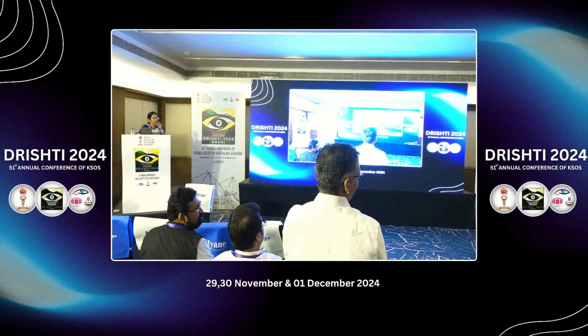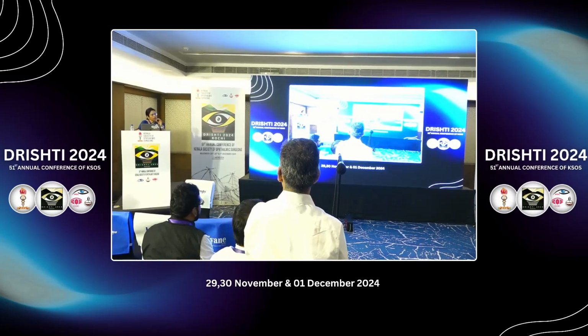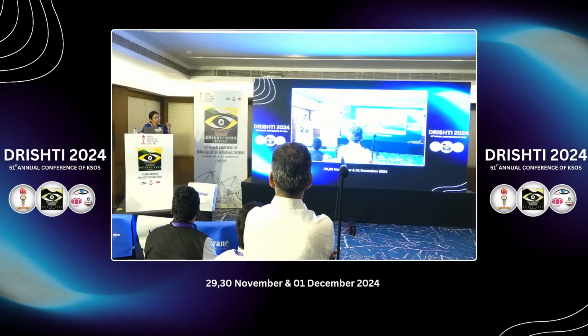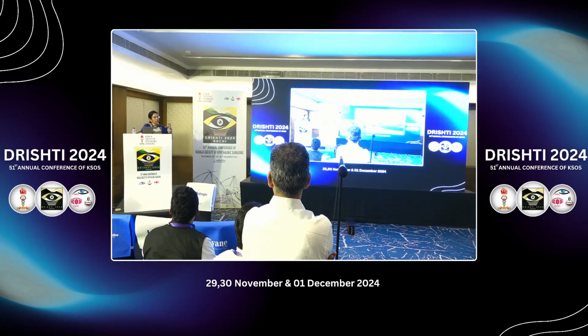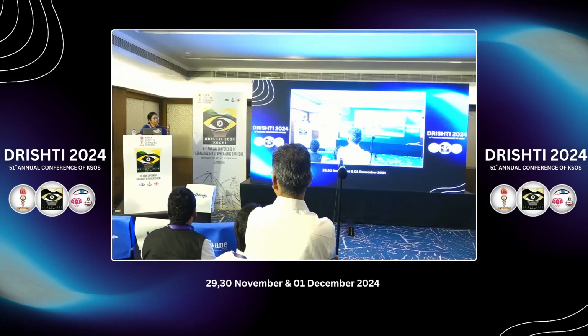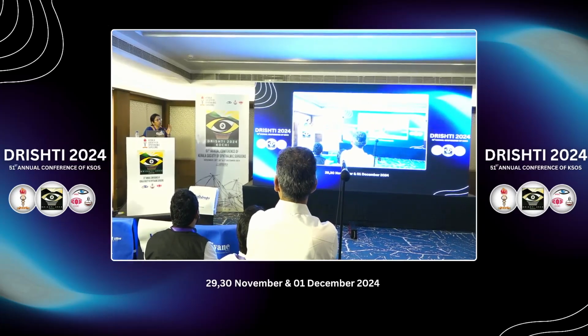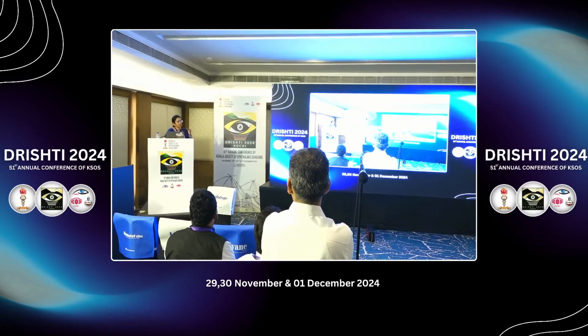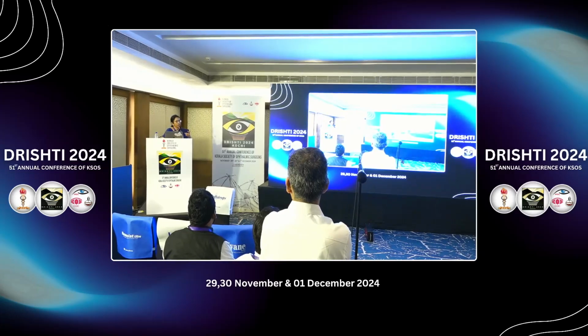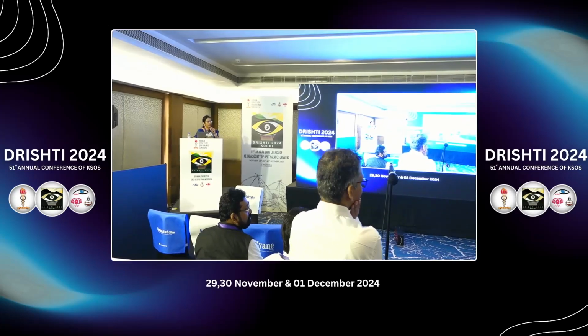Yeah, I always feel three-piece has a better memory, and I think when you're expecting some fluctuations, the thing is with single piece lenses, the haptics usually unfold in a controlled manner. But with three-piece lenses, you should be very careful while injecting these lenses. And also, if there are high-risk cases, it is better to have a backup of three-piece lens, because if there is any PC rent, which is unexpected, then you can place the lens in the sulcus and do an optic capture.